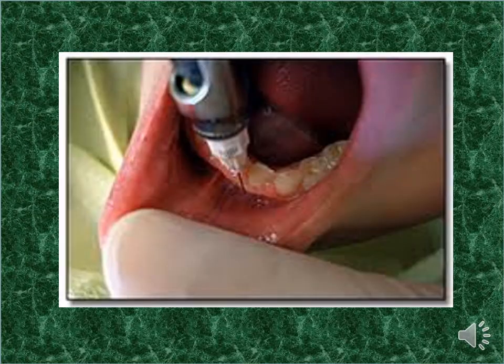We do this technique on the labial side, and we can give infiltration on the lingual side, slightly above the floor of the mouth, with a slight amount of local anesthetic solution to anesthetize the lingual gingiva.